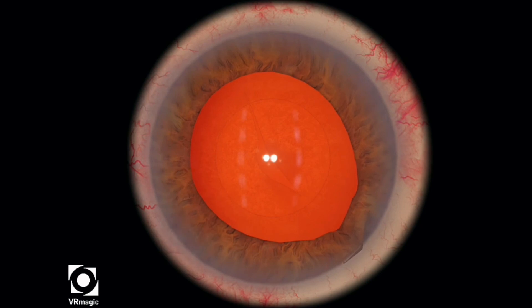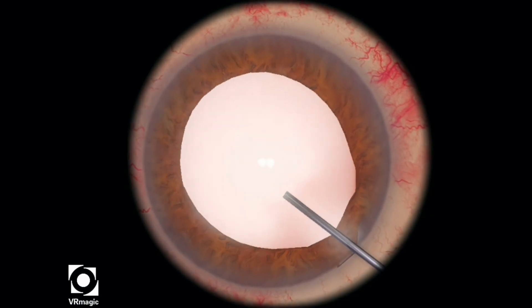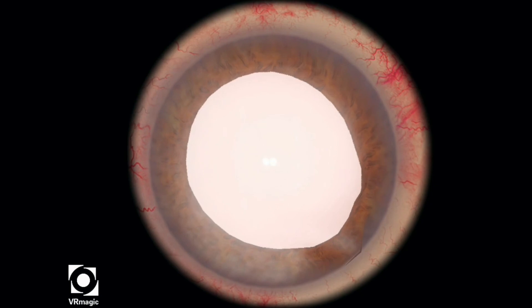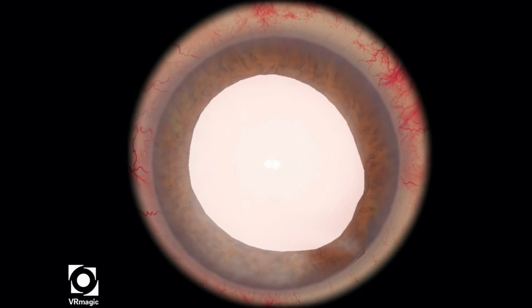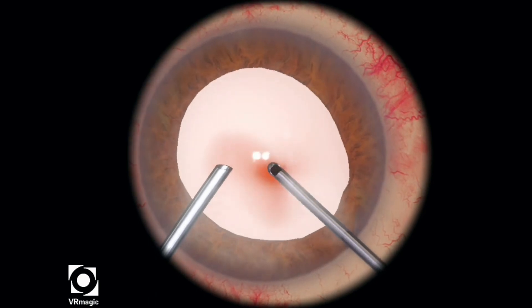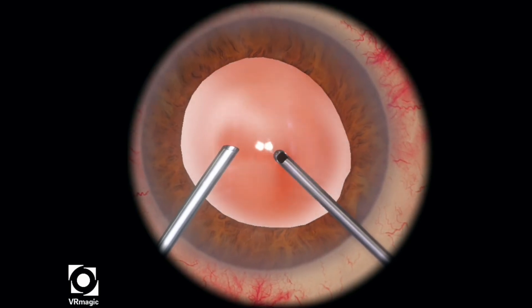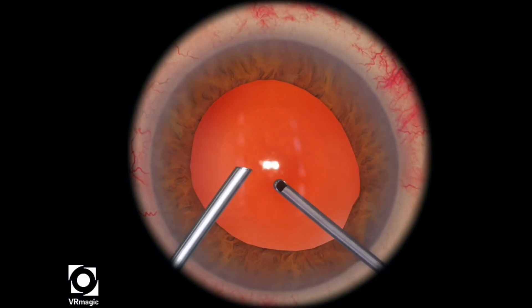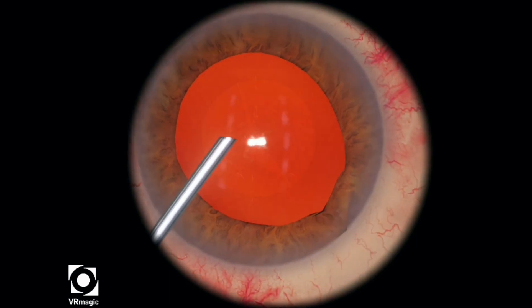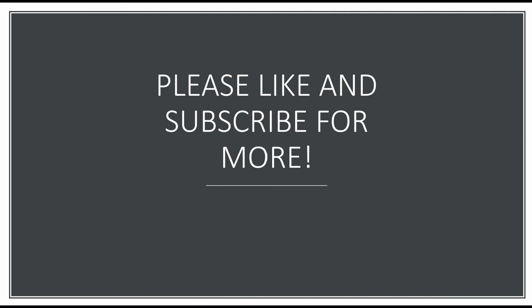That looks pretty good. I'm staining it one more time just to make absolutely sure I'm not missing anything. And I think I'm in the clear. We scored 197 — I think I left a little bit of vitreous in the anterior chamber for the last one.